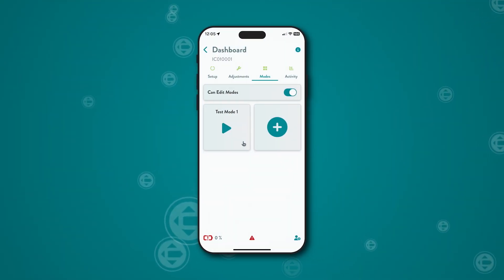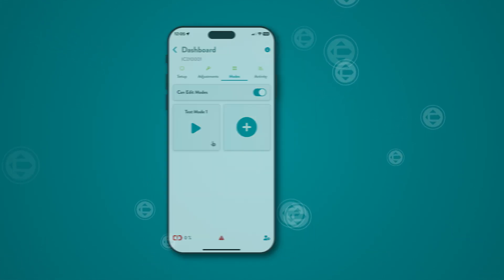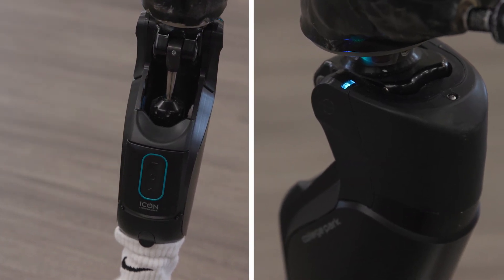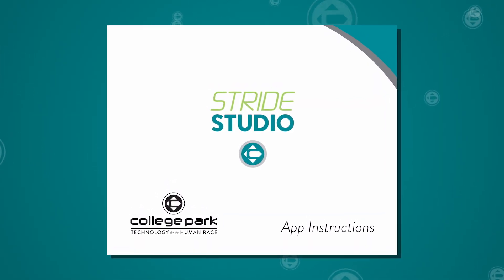There is a custom mode screen that allows programming for up to ten activity-specific modes for the user. Custom modes are optional and users can only access them if the prosthetist grants permission. For detailed info on programming custom modes, refer to the Stride Studio app instructions.